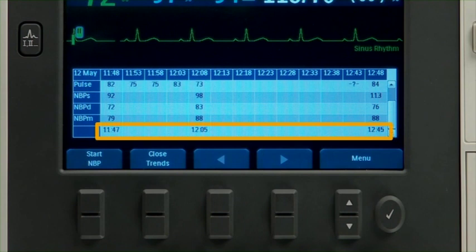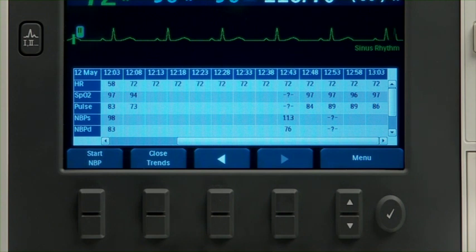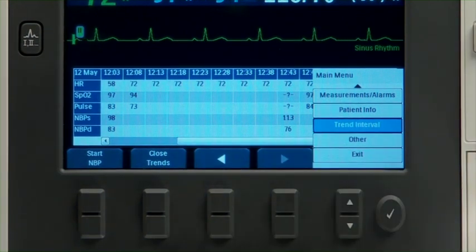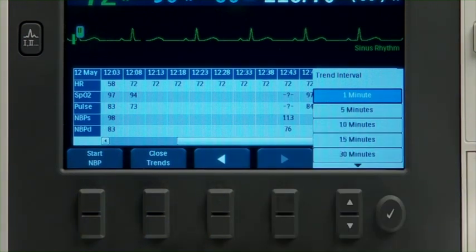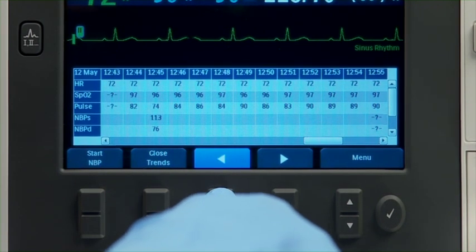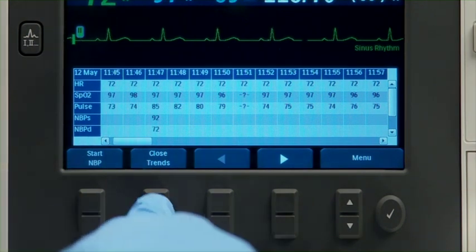Periodic measurements such as NBP include a time stamp. You can adjust the display's time interval for the current patient. With vital signs trending active on the display, press the Menu Select button, navigate to Trend Interval, and press Menu Select. Use the navigation buttons to select the trend interval you want and press Menu Select. Use the soft keys to scroll backward and forward in the vital signs trending report. When there is no more data in a particular direction, the soft key becomes inactive. To exit the trending report, press the Close Trends soft key.